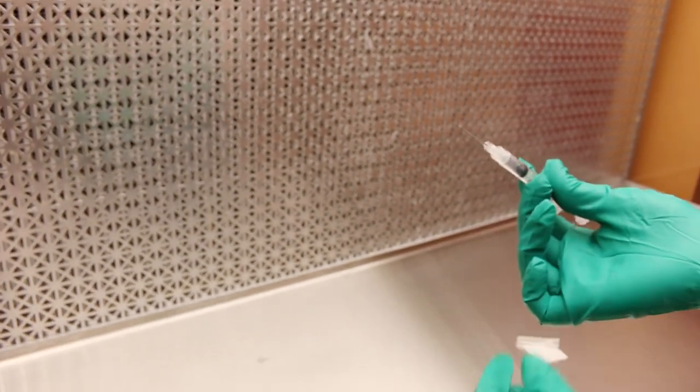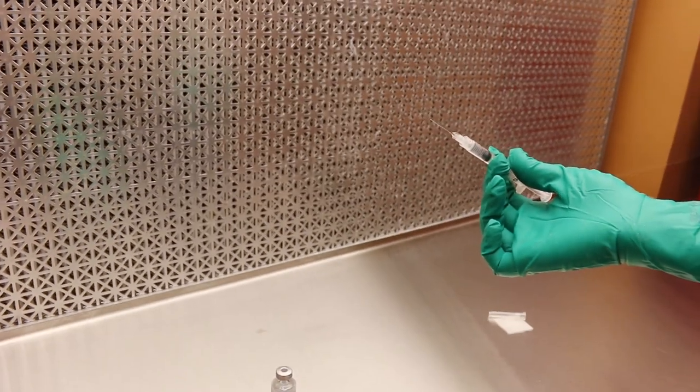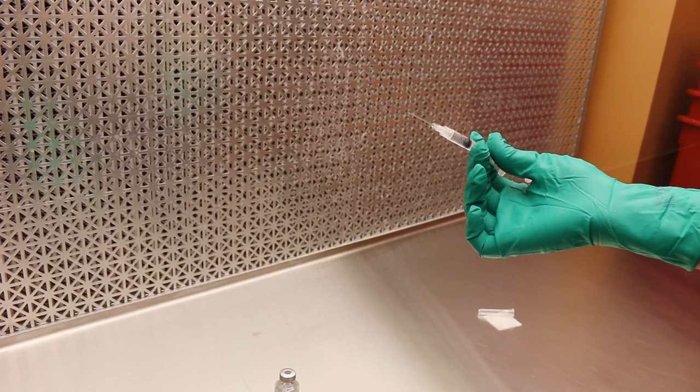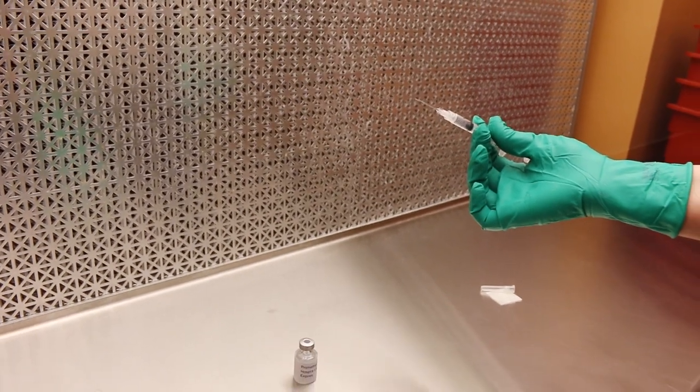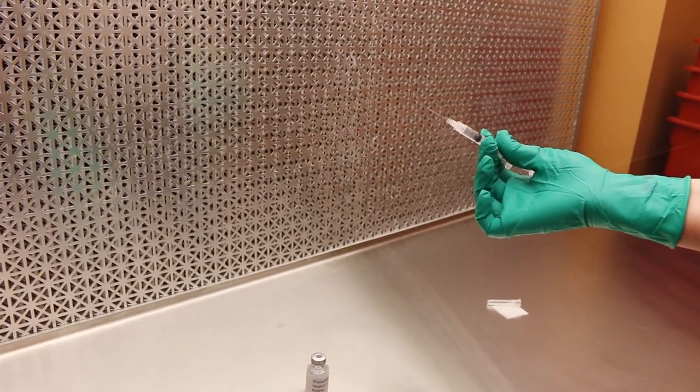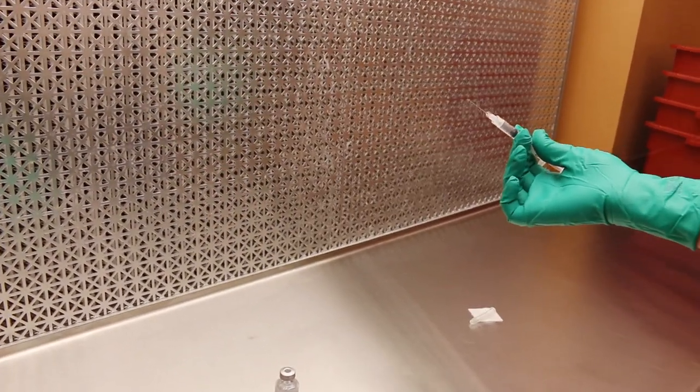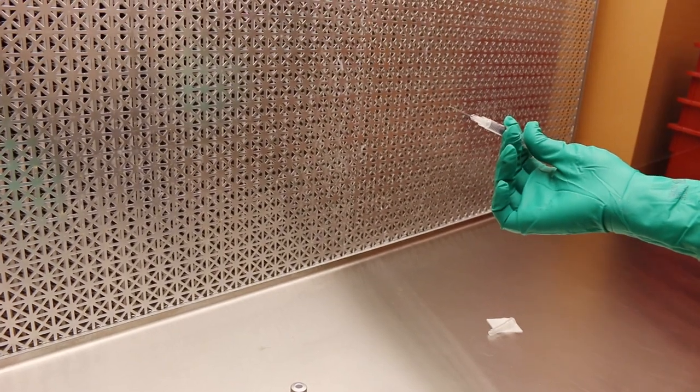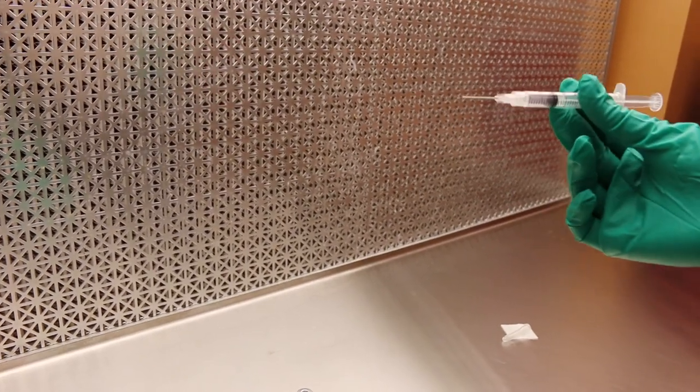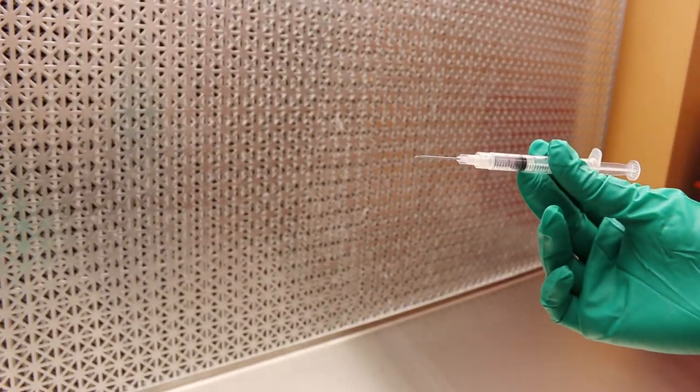Step sixteen, use the dominant hand to grasp the syringe at the barrel. Use your non-dominant hand to remove the needle cap, and place the cap on the alcohol swab on the hood's work surface. Step seventeen, use your fingers to rotate the barrel of the syringe so that the bevel of the needle is pointed toward the ceiling.